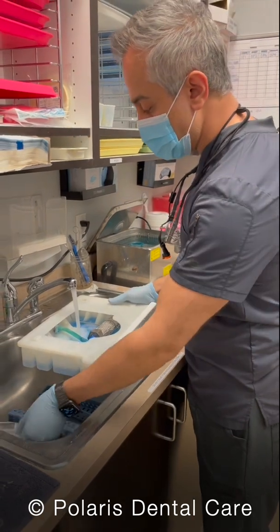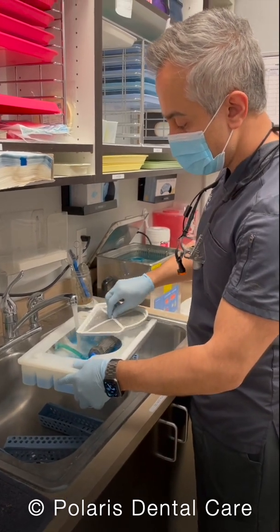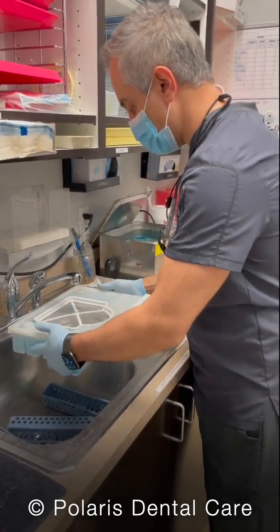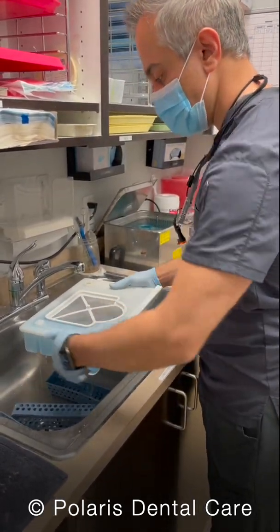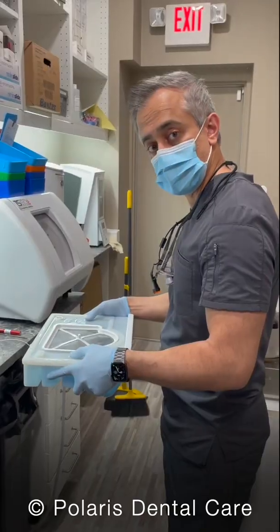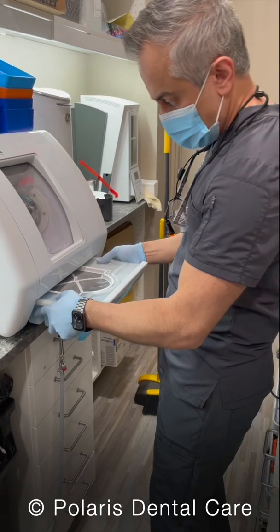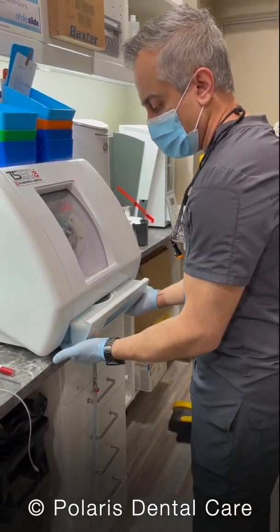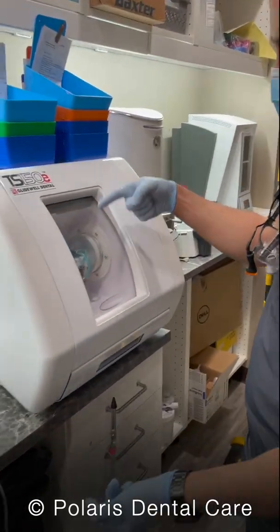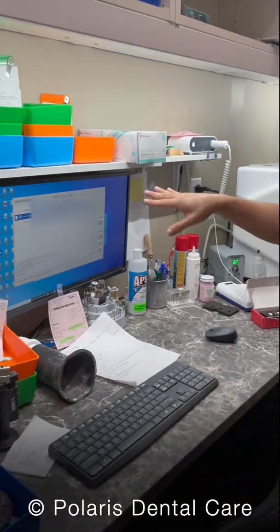Now we'll fill this to the top with water. I'm going to fill it all the way until the top — now I can see it's completely full. We're going to take this back and reinsert it into the machine. Be careful holding it; it does get a little heavy. It will push in all the way. Once it's inserted, the machine will circulate a little bit, and we can see that it has started the process.